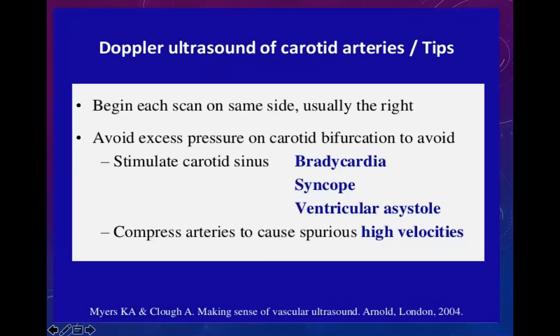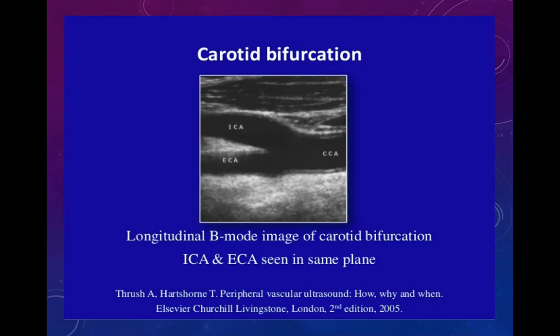And first of all, like every Doppler examination, I've always said that before going into any other mode, have a thorough B mode examination of the artery. It gives you very valuable information regarding thrombus, regarding plaques, regarding anatomy, regarding variations. So never ever skip the B mode. Devote as much time as you can to the B mode examination, both in the longitudinal and the transverse.